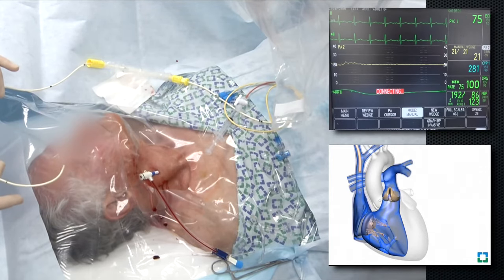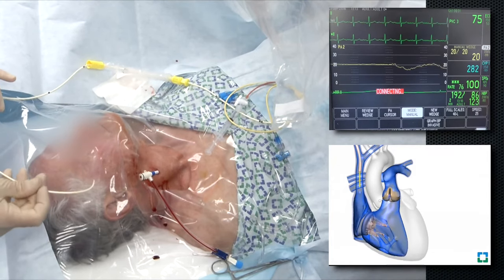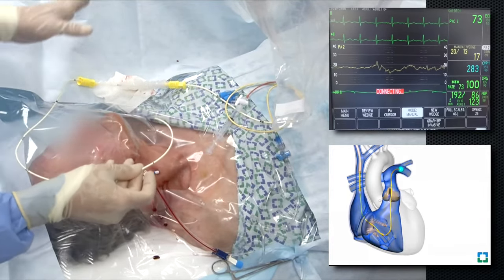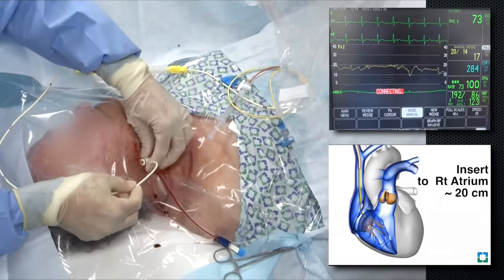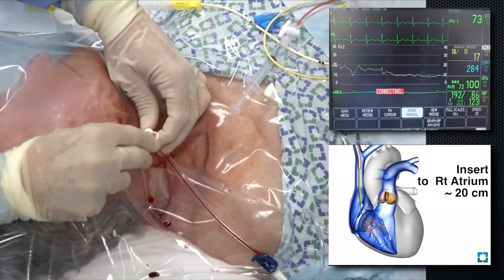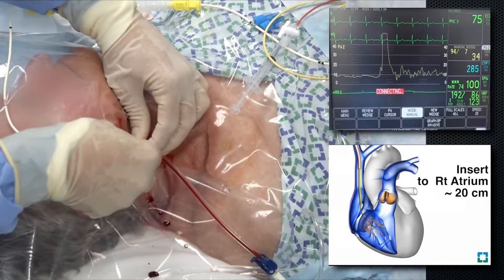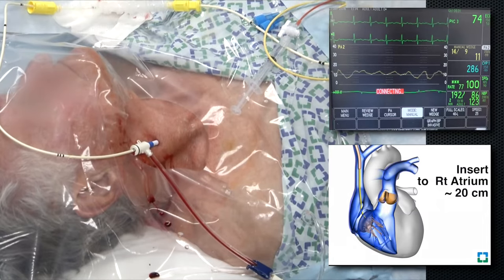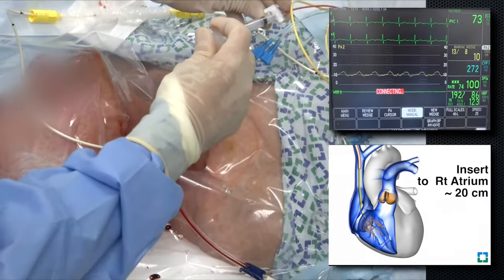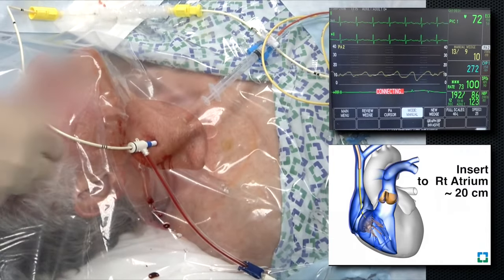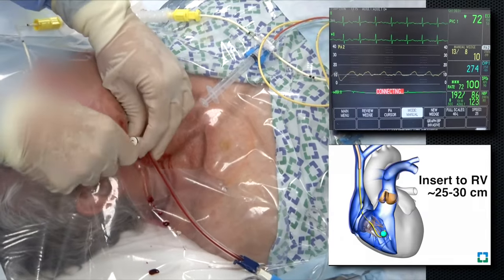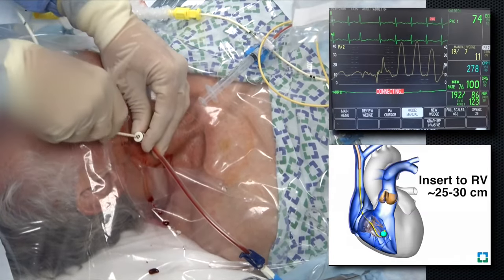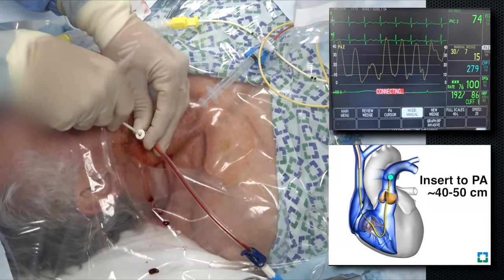You are now ready to insert the pulmonary artery catheter. As shown, the pulmonary artery catheter is curved in a counter-clockwise fashion at the distal end. This assists the catheter in making the necessary turn at the right ventricle to enter the pulmonary artery. The catheter is inserted through the 8.5 French introducer sheath to a distance of 20 centimeters, which should place the distal tip into the right atrium. This can be confirmed by noting a right atrial pressure waveform. Once confirmed, the balloon is inflated with air using the 1.5 mL syringe, and the catheter is advanced into the right ventricle and then into the pulmonary artery. Advancement is confirmed by noting appropriate waveforms and pressures in both the right ventricle and pulmonary artery, which should be recorded.